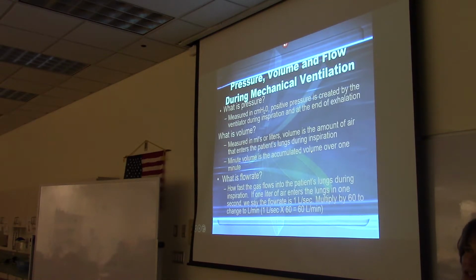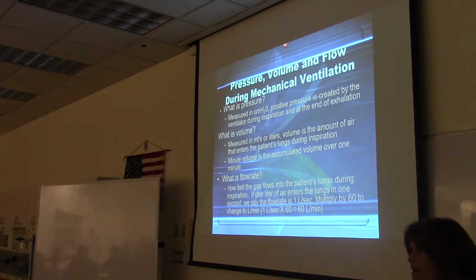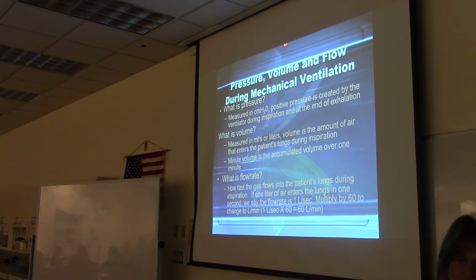All right, and then I want to just spend a couple minutes and tell you about airway graphics. On any ventilator that you turn on, the first thing that you see are airway graphics. I want you to be really comfortable with them, know exactly what you're looking at. So this is just your introduction.